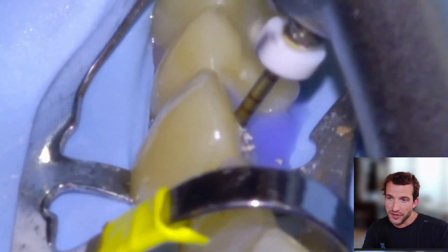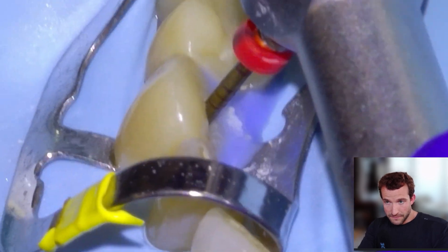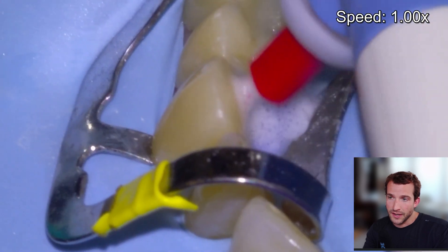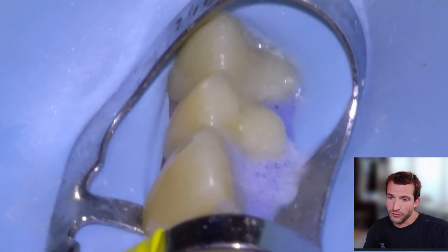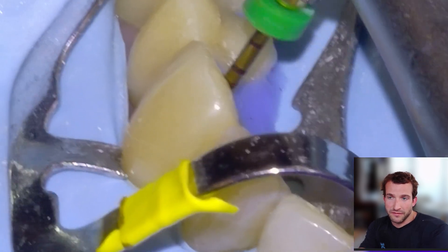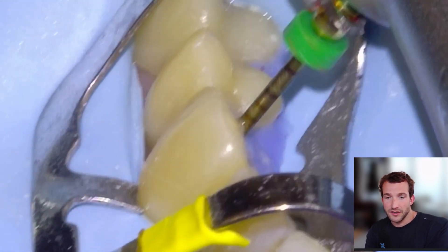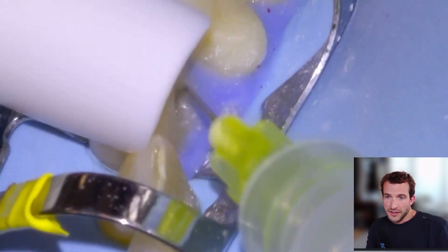Just going to take our files to length all the way down to the green line at least. Usually the glide path file will go down to the red line, especially in necrotic cases. The 2504 file is next, and we'll take that down to the green line with our RC prep. Our last two files — second to last is a 2506. We're going to use the endo activator after to attempt to sterilize the apex. Then we'll go in with our final file, which is going to be a 3506. Typically 3506 is pretty much always what I'll finish my endos with, unless it's a lateral or a really small tooth where dentin preservation is super important. I've read papers saying that 25 finishing diameter is sometimes not quite enough to sterilize the apex, but 35 is a better number to finish at. So we'll take our 35 to length.